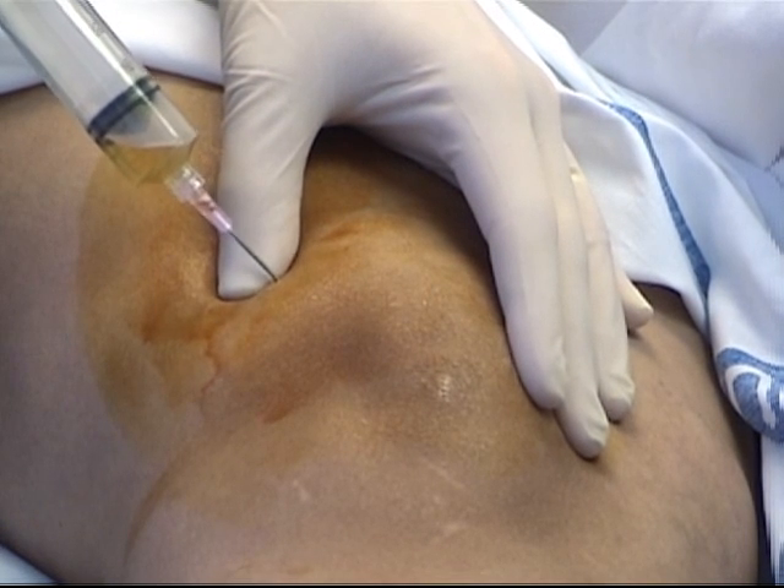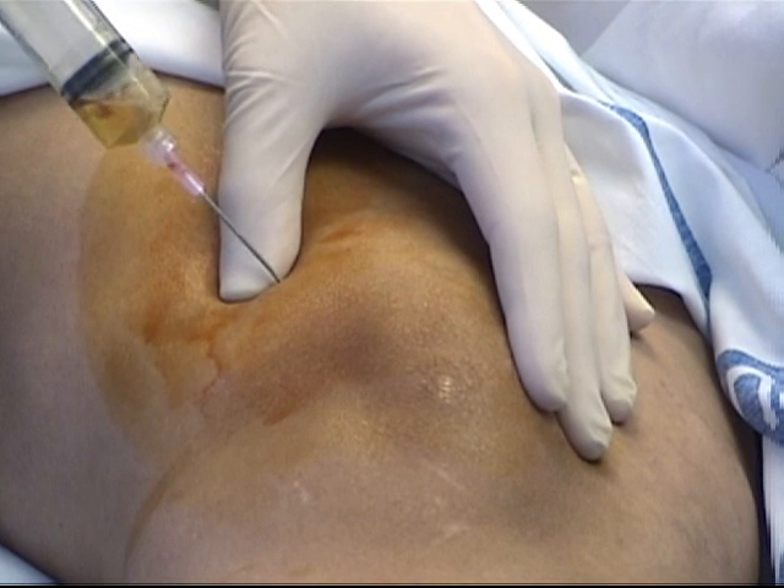After obtaining the desired amount of fluid, withdraw the needle and cover the entry wound.